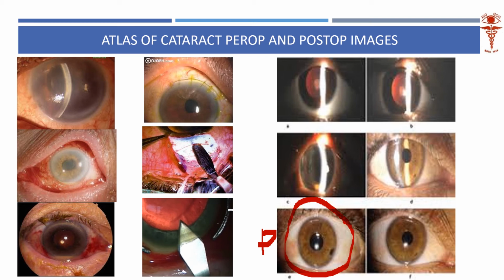But incidentally, because of many factors, which can be patient factors or surgeon factors, the patient ends up with certain complications. One of those complications is these sutures. Can you see? They start with SICS, but then they have to convert it into ECCE, and finally they have to finish the surgery and do sutures. That is one thing. If SICS is completed by itself, then it will become a sealed wound because of the valve. But if it is converted to ECCE, then you'll have to suture that wound.